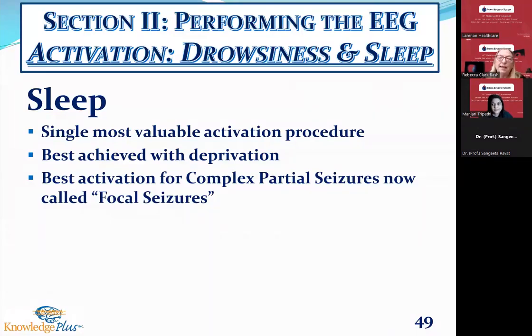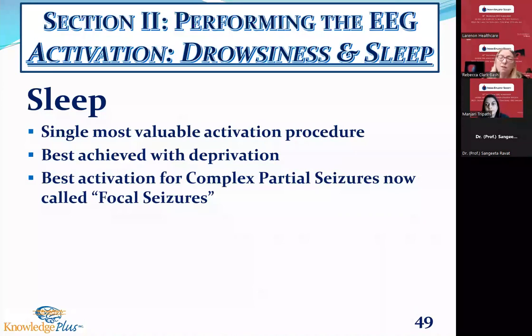Now, the next big recommendation I have is that other staff in the department need to know it is not acceptable to come into my exam room while I'm doing my EEG. If the secretary or anybody opens that door and they're almost asleep, they're going to wake up and not go back to sleep. So there has to be a sleep test in session. Do not enter the room.